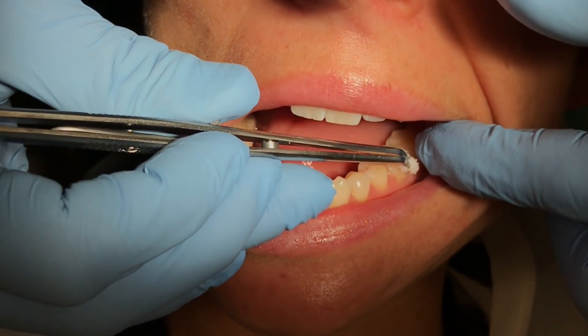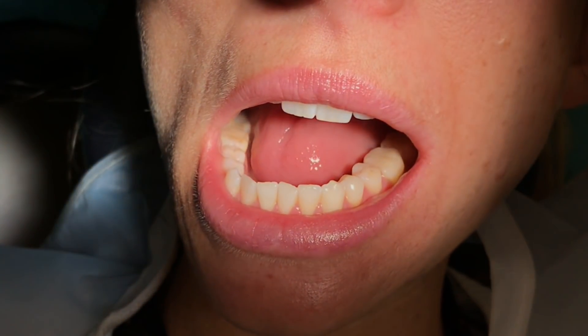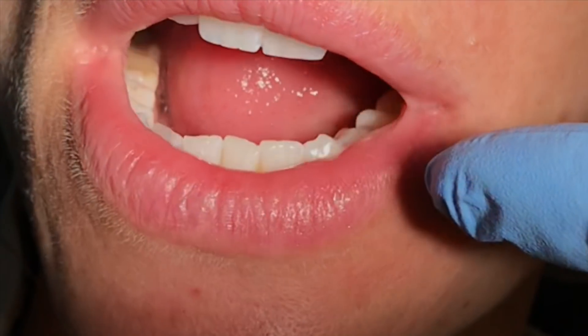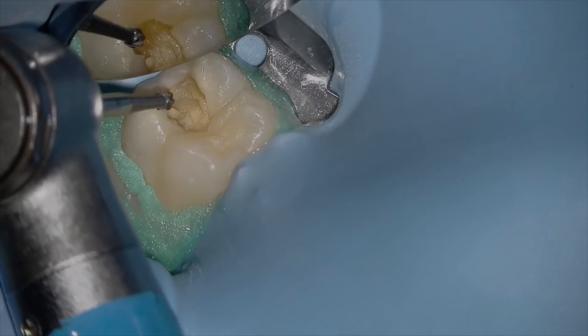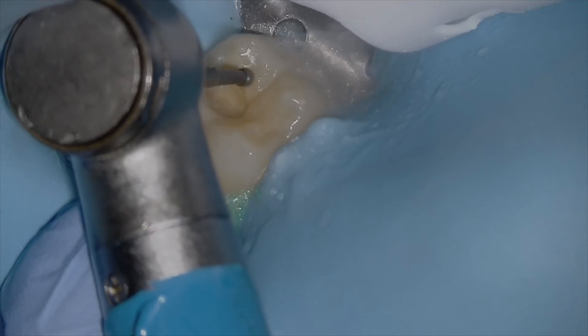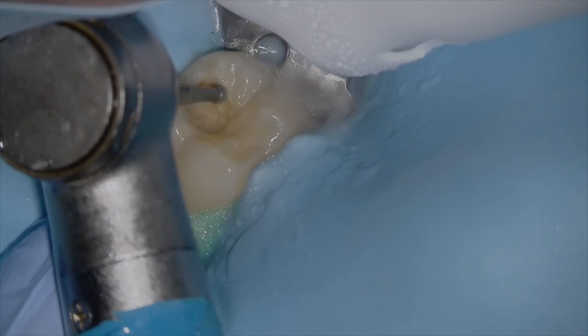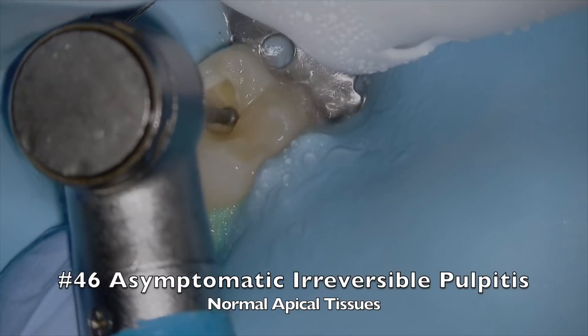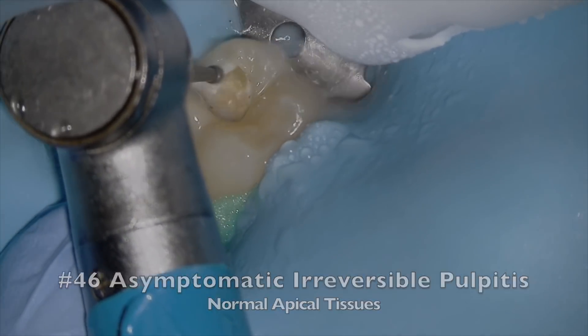Part of the examination process includes a cold test. This is a critical test and it helps you determine the next step. If the tooth didn't respond to cold and our diagnosis was necrotic, then a regeneration process may be initiated. This little guy responded to cold, so we're able to go with caries removal and the planned pulp capping. We diagnosed this tooth with asymptomatic irreversible pulpitis with normal apical tissues.